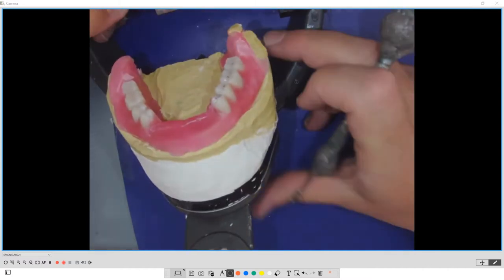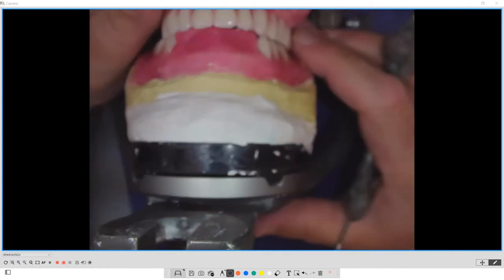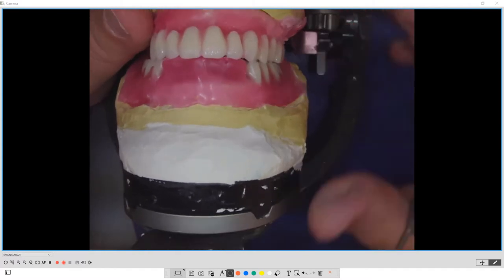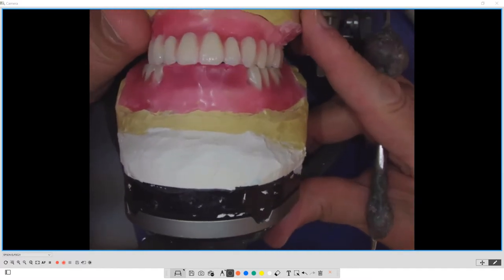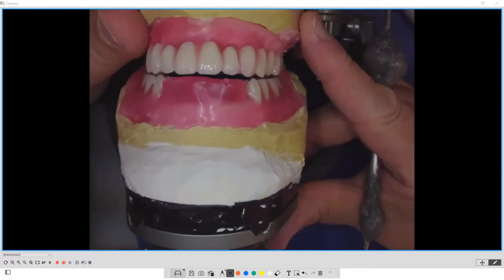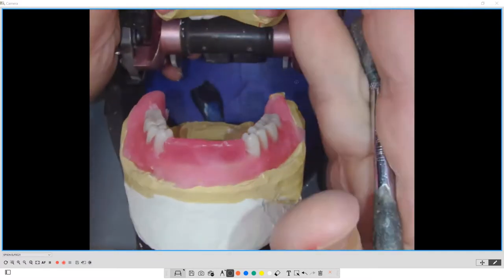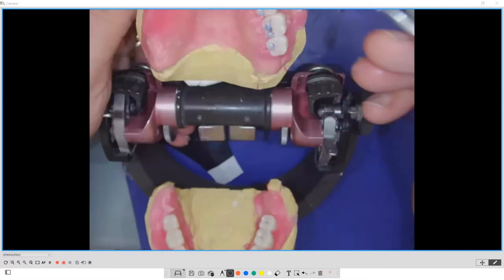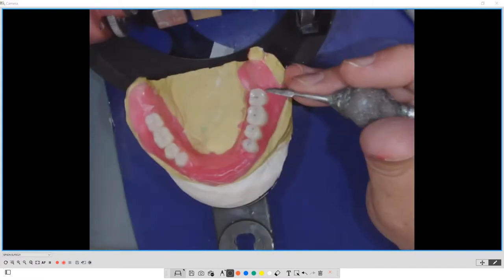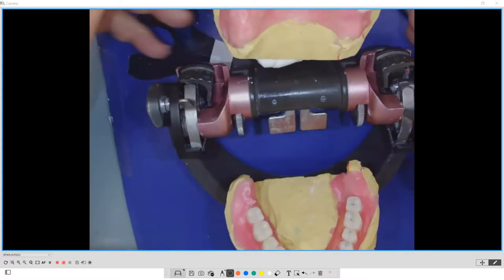So the whole goal behind this is stability of the denture in the patient's mouth. When it goes under function, it does not function like this in the mouth. It functions like this in the mouth. Challenge yourself. So this goes now and functions. So now I have a helicopter pad to land on. I'm checking the guiding planes of the teeth to look for hit and slide, because the hit and slide causes the damage. So this is the same thing now digitally.